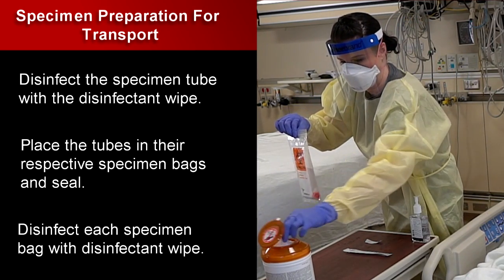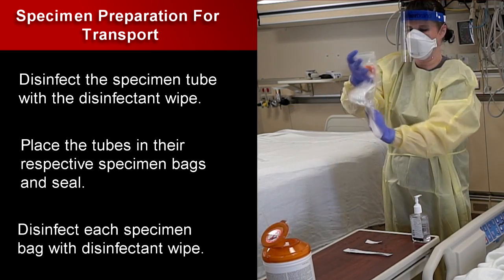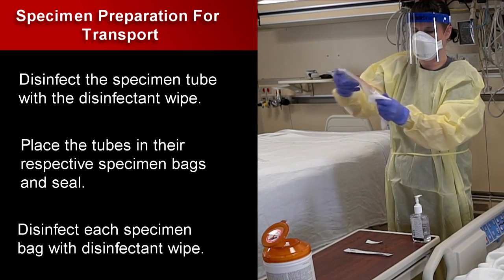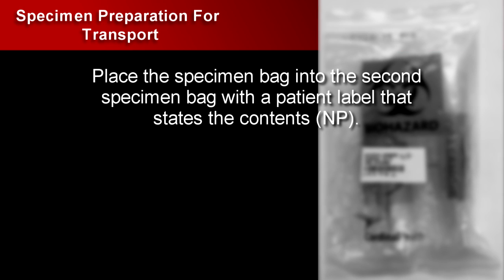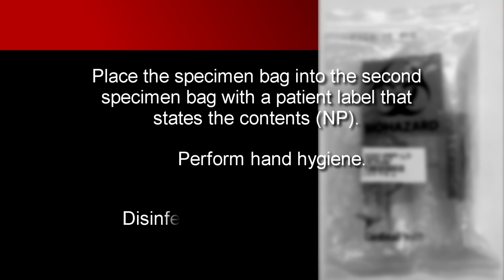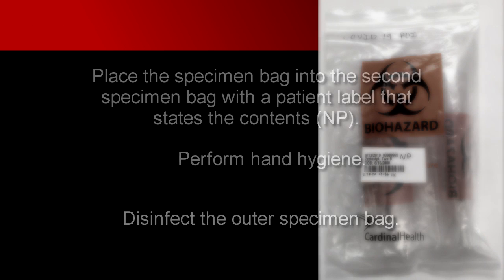Disinfect the specimen bag with disinfectant wipe. Place the specimen bag into the second specimen bag with a patient label that states the contents, NP. Perform hand hygiene. Disinfect the outer specimen bag.